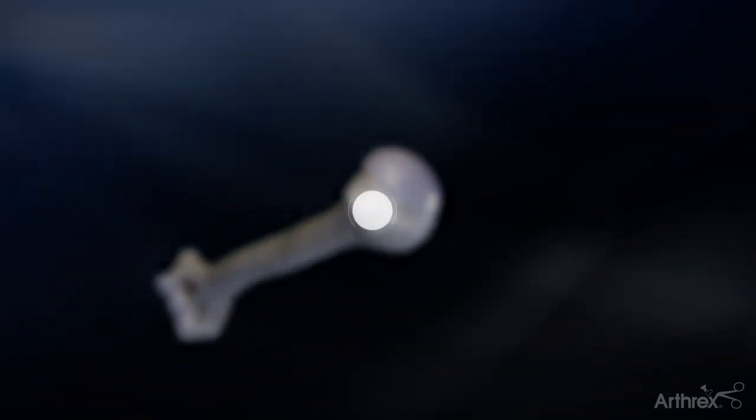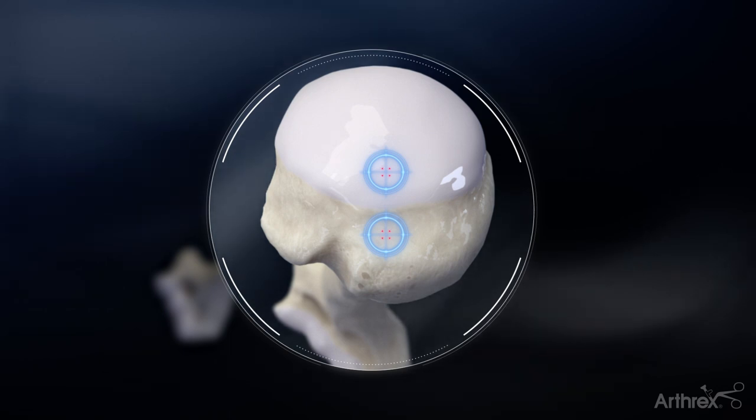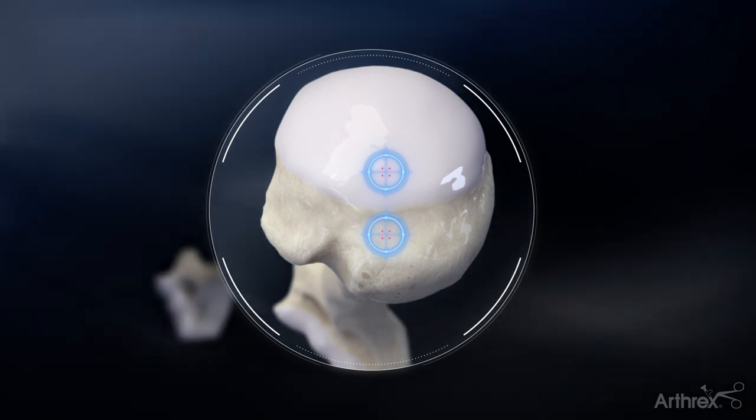There are two acceptable entry points for the nail: one is just medial to the greater tuberosity, or in the center of the humeral head, straight down the humeral shaft.